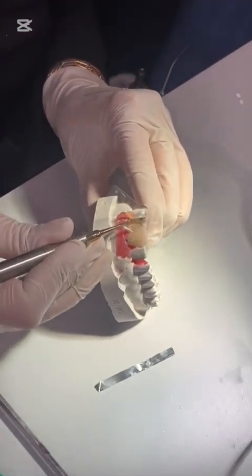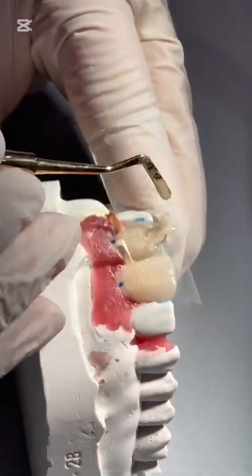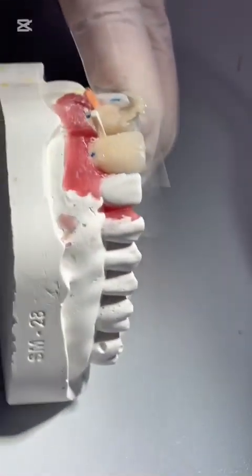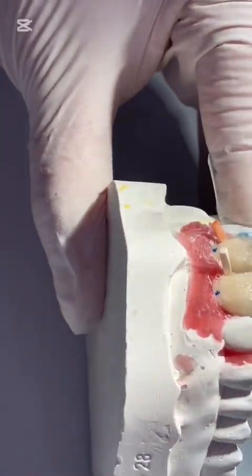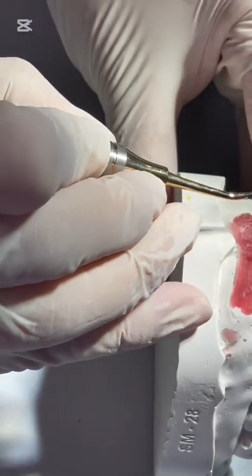Flowable no. It's a composite type, flowable composite. I think it's for better adaptation.